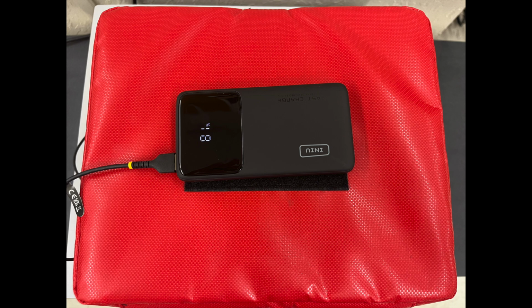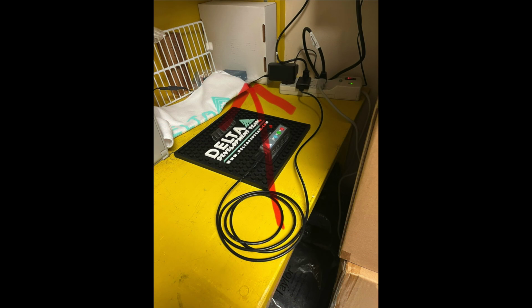or higher. If for some reason it is below 30%, you can recharge it using the same cord that's plugged in. You just need to reverse it and use the USB adapter, and the plug-in part is inside this white box. It's either on top of the freezer or this is EMS 22's. There's a USB adapter in there that you can plug it into the wall and recharge the battery until it gets to 100%.